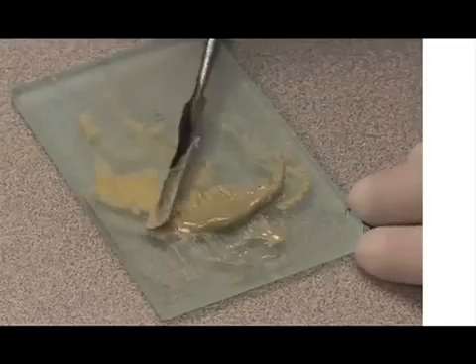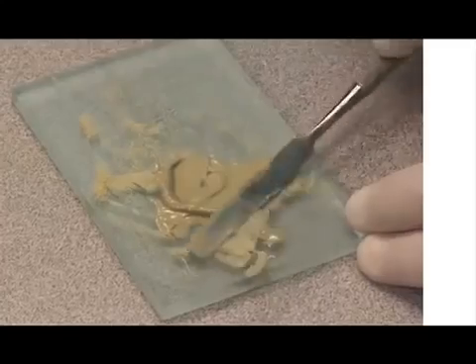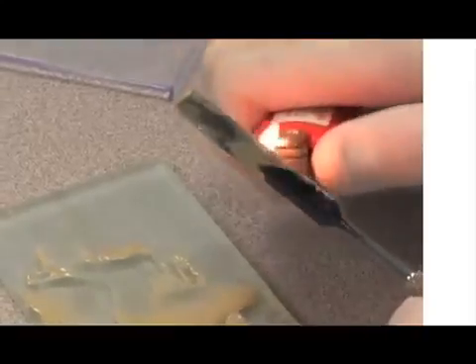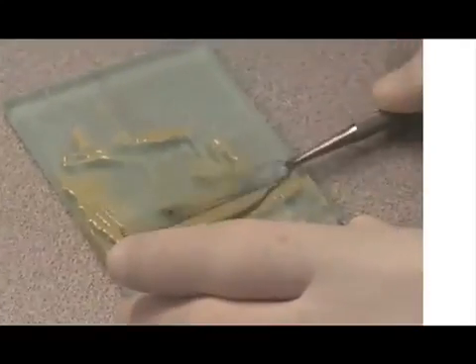While the above is good for a demonstration, in reality I simply place enough powder on a glass slab for the obturation of the tooth in question. I then dispense enough gel to make the flowable cement to the desired consistency. The ratio is a guide, but a wide margin of acceptability exists with epoxy resin cements that preclude the need for precise drops and scoops.